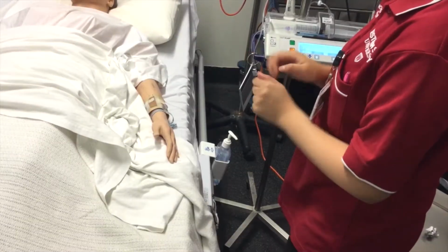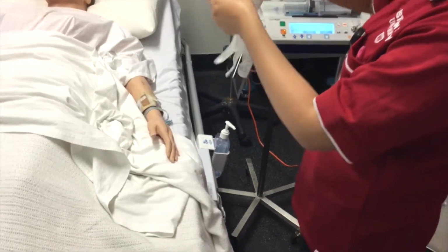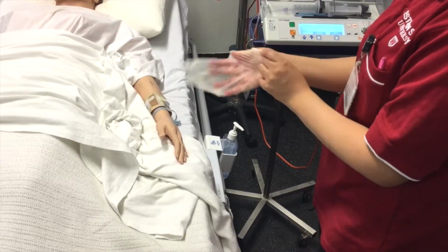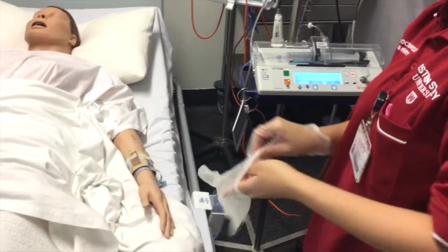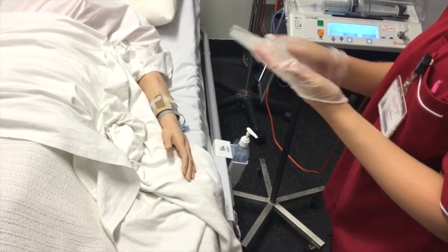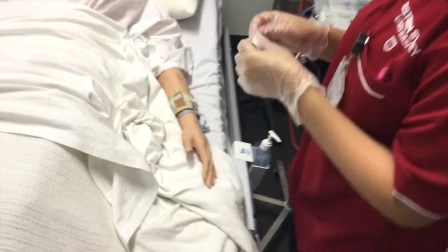Okay, Miriam, so I've set up your PCA machine. What I'll do is I'll just give you the morphine now, so you can get relief of your pain. What I'm doing is I'm just putting on my gloves. Okay, and I'll alcohol wipe the site first.